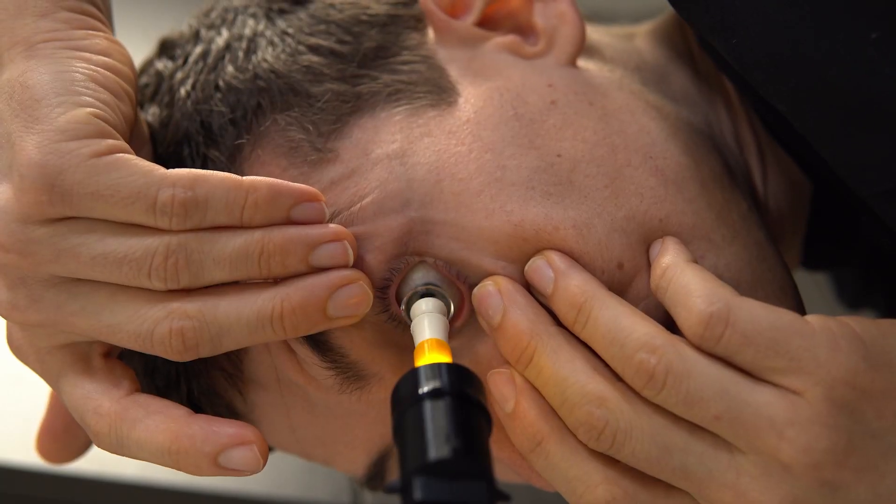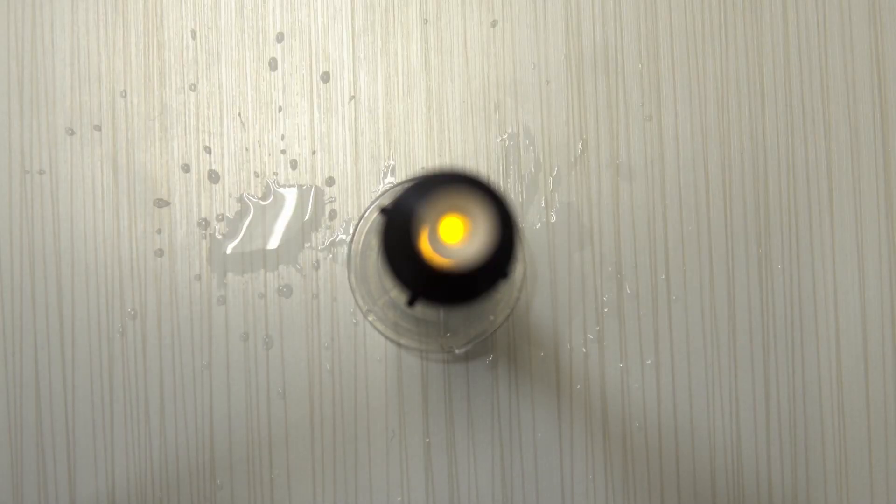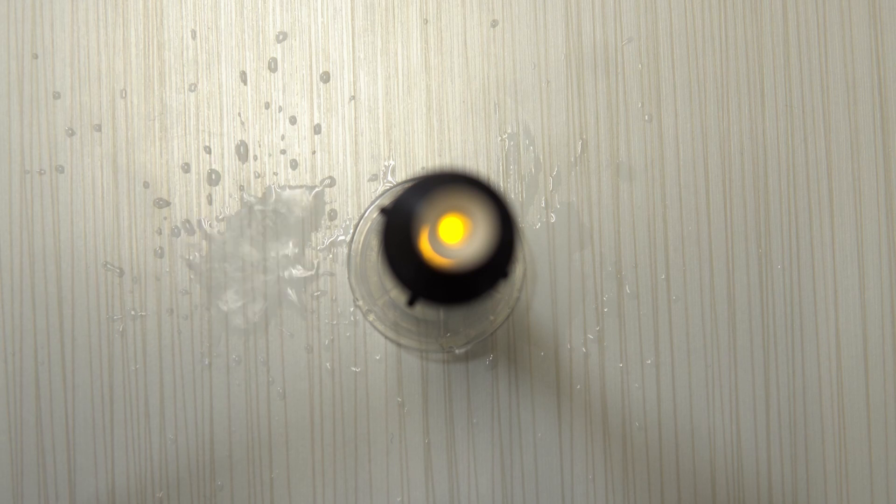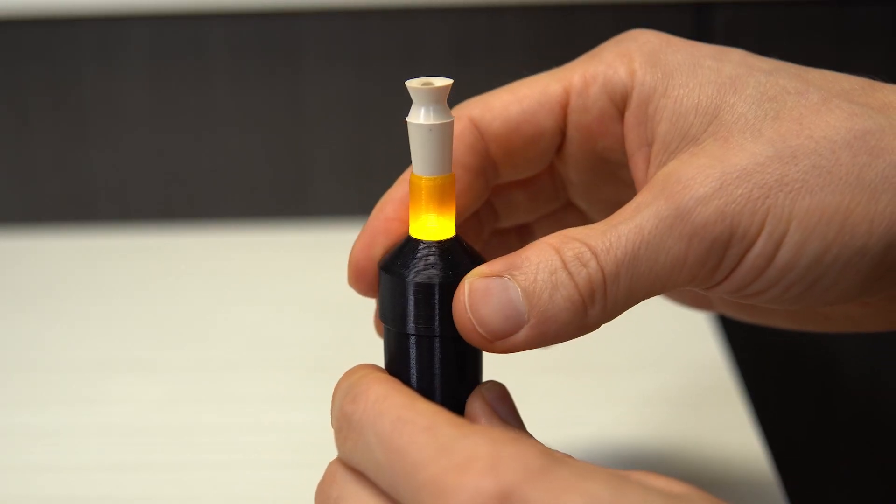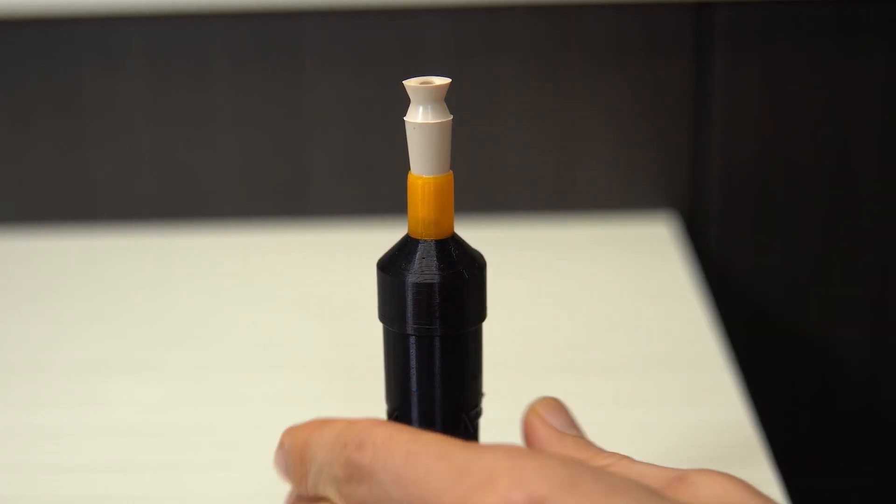The excess saline solution will typically spill out of the lens bowl when your eye makes contact with the lens. Step five: twist the top half of the light unit clockwise to turn off the light.